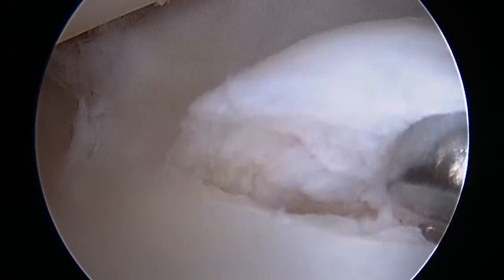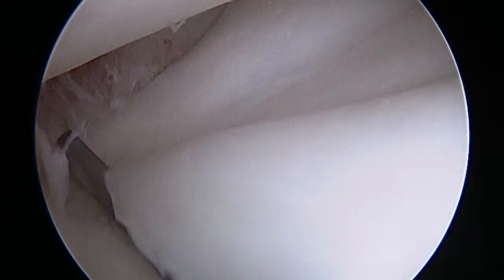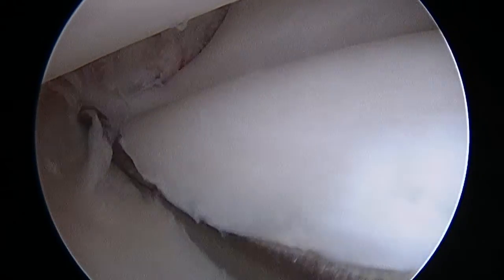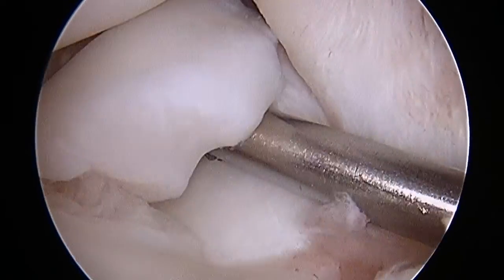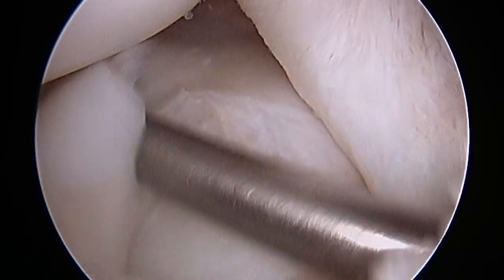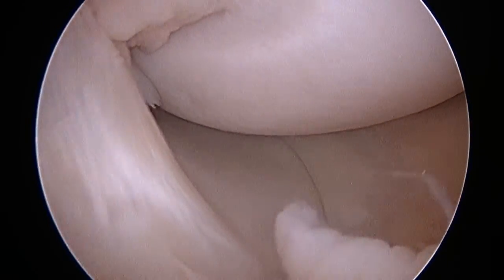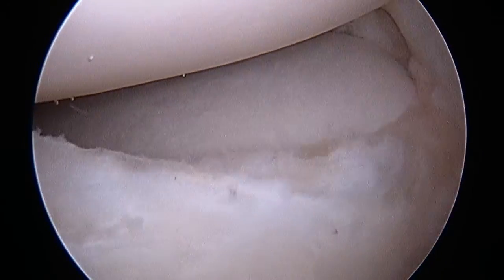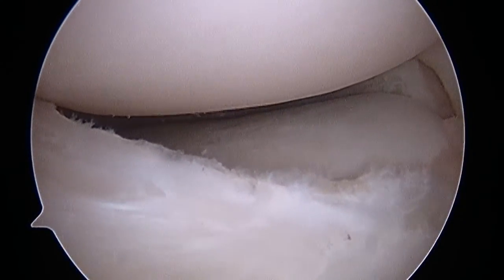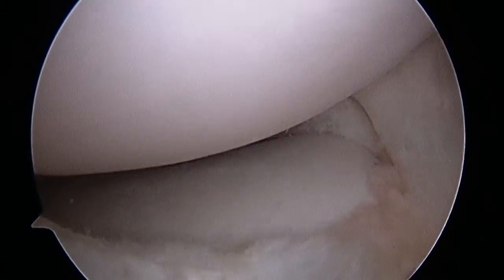What we're going to do in this procedure is trim the meniscus back to a more normal shaped meniscus. Here you can see me trimming the anterior horn of the meniscus back to a normal width. Once I'm into the tear on that side I trim it posteriorly, trimming the posterior horn back down to a more normal appearing meniscus. In the end he ends up with a lateral meniscus that looks like it should — fairly normal appearing. As I take the knee through a range of motion there's no more entrapment and no excessive force on the lateral meniscus.